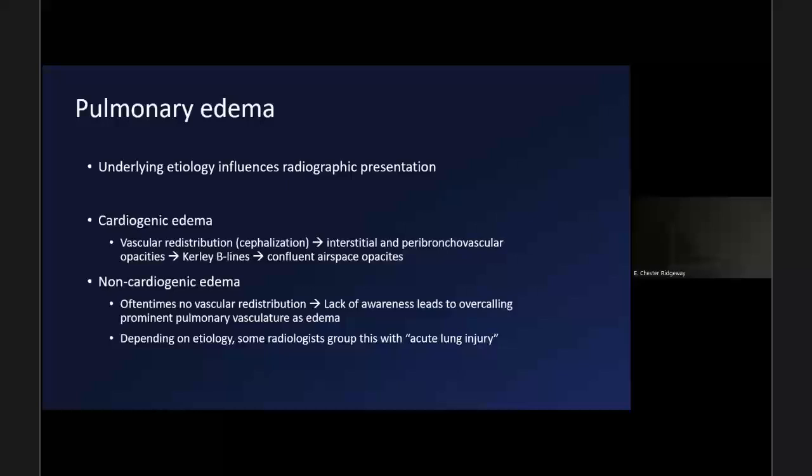On the flip side of that is non-cardiogenic edema. Oftentimes with non-cardiogenic edema, we don't see that vascular redistribution. We cannot rely on that. The lack of awareness of this particular caveat is what leads radiologists, in particular, to overcall edema.